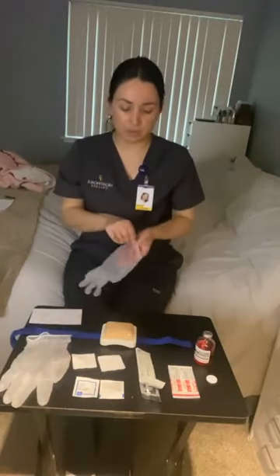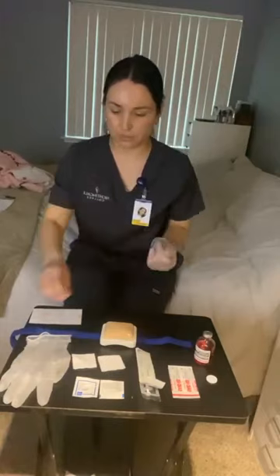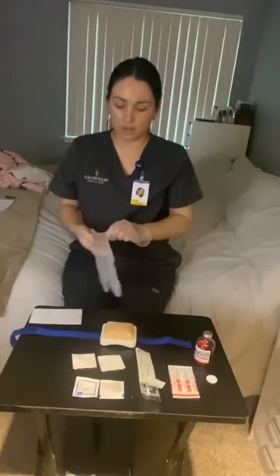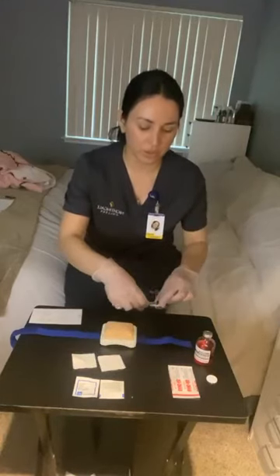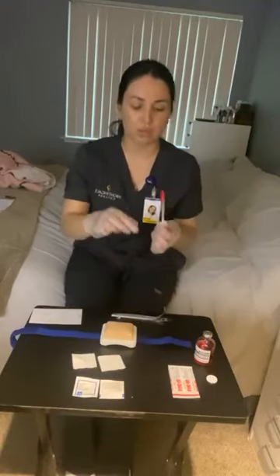So I would perform hand hygiene and apply my gloves. Get my syringe and needle with the cap still on and facing up. I'm going to fill it with air to the prescribed dose of 1 milliliter.